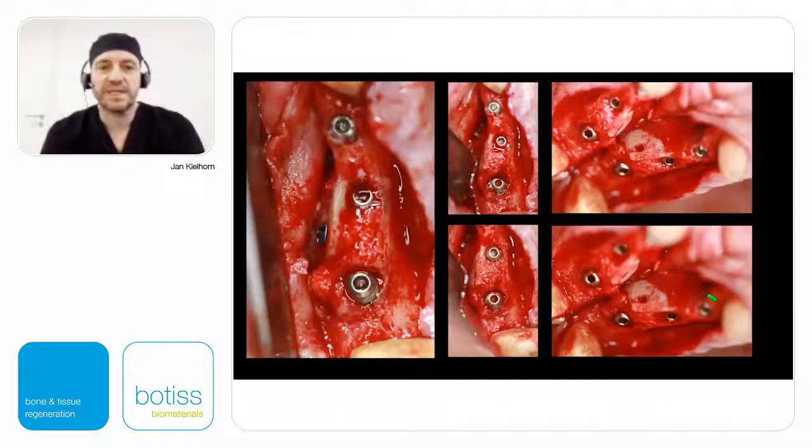So then you see the screw still here, so there's no resorption taking place. The screw is still in place. There's no resorption, and now we can place in 3 implants, which has been nothing. You've seen it. This was all gone till the sinus floor. So all this is augmented bone. You see the nice integration of the bone plate, and the nice width and height we regenerated just by using allograft particles and a bony cortical strut.